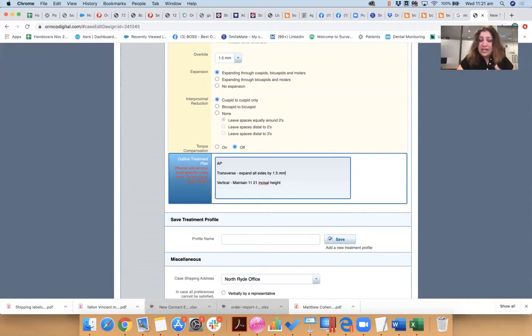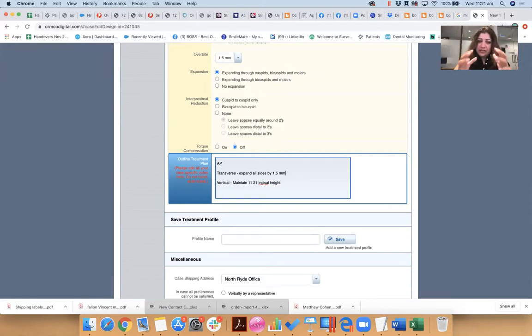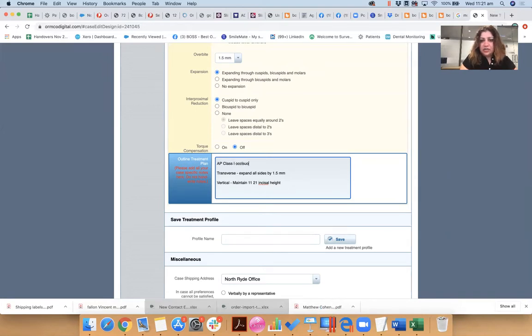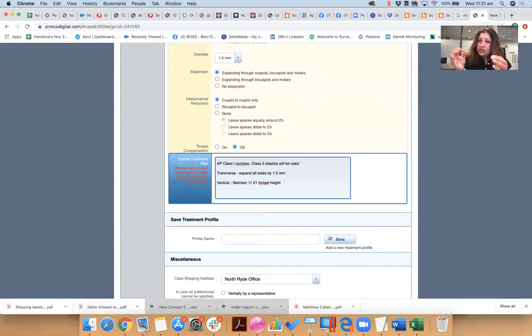Now we know with molar, it'll be uprighting movements rather than bodily. We understand that. AP, do we want Class I occlusion at the end? You know, and how are we going to get it? So you might want to tell the technician, Class II elastics will be used.